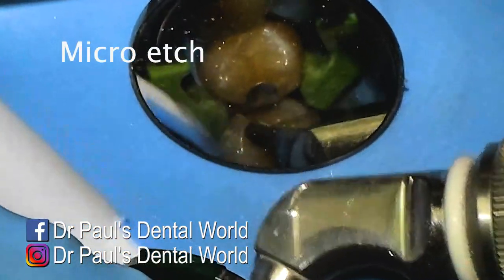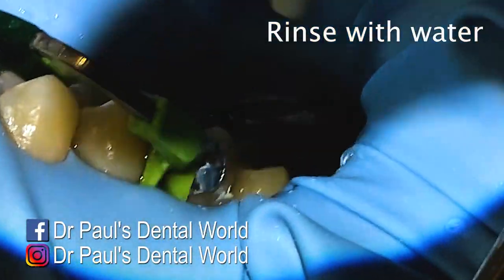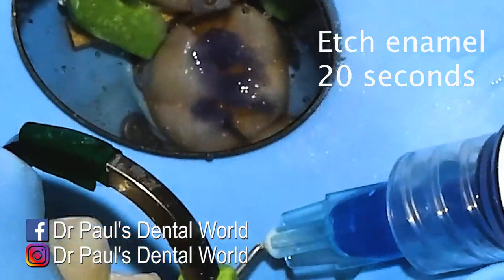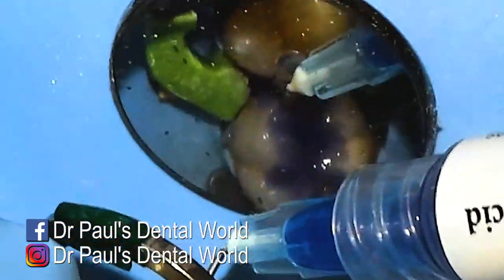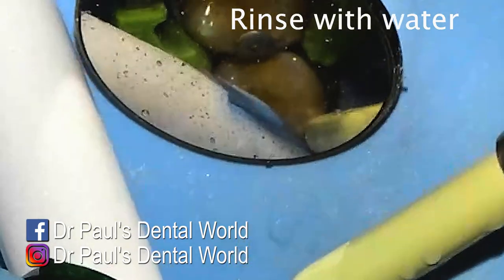Then I'm going to use my micro-etch — this removes any plaque and also opens up the enamel pore slightly to get better bonding. Then I'll rinse it off and etch the enamel. Try to only etch the enamel — if you etch the dentine it can lead to a decrease in bond strength but also some sensitivity. We're going to leave this in place for about 20 seconds, then rinse with water.